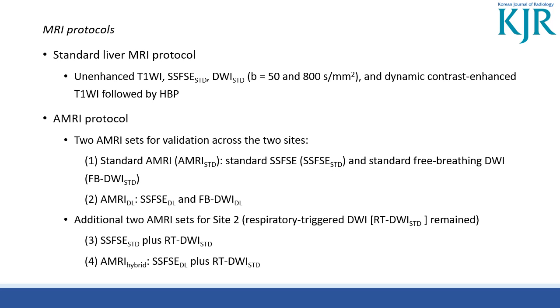We used the standard liver MRI protocol with generally accepted sequences. For the AMRI protocol, we designed two main AMRI sets across the two sites. The standard AMRI consists of a combination of standard SSFSE and standard free-breathing DWI. The AMRI-DL was composed of the same sequences but with deep learning reconstruction applied.